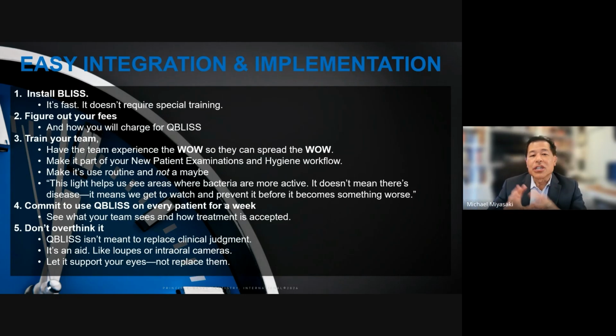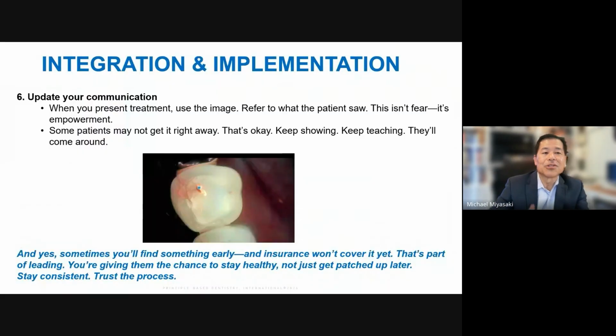And remember, it's just an aid. It's like your loupes or another intraoral camera. It's going to support what you see. It's going to help you see more. But don't worry. Don't overthink it. It's just as you use it, you'll figure it out.